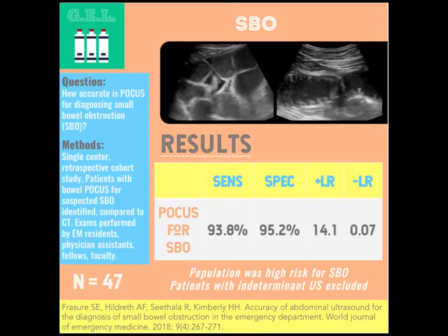Again, all patients underwent both a point-of-care ultrasound and a CT scan as the gold standard to look for a small bowel obstruction. So this is really the first study, to our knowledge, that included physician's assistants as ultrasound operators in the ED as well.